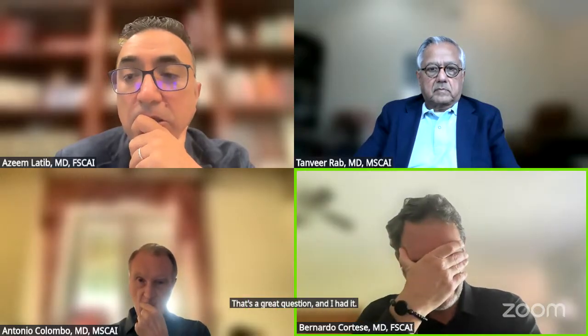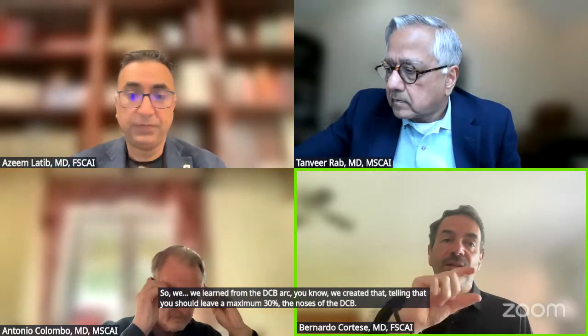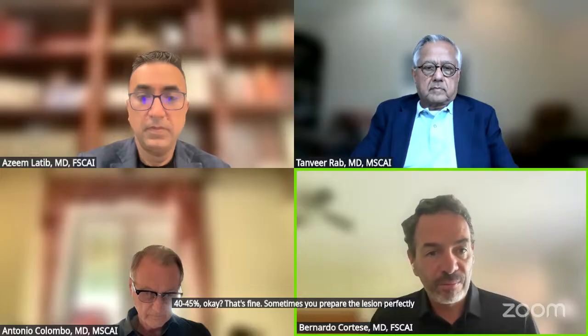That's a great question, and I had a terrible case last week about that. So we learned from the DCB ARC, we created that, telling that you should leave a maximum 30% stenosis after DCB, unless it's within a very long lesion. In this case, you can also accept some focal 40-45%. Okay, that's fine. Sometimes you prepare the lesion perfectly using DCB and you have recoil. That's real life. It's quite uncommon, but it may happen.